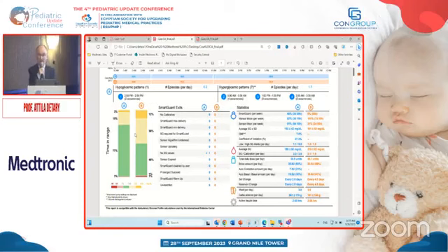So what you also see in the statistics is that we have the GMI information for the recent 2 weeks. It is 7.0%. Imagine you put the patient on this technology and in a couple of weeks, the expected hemoglobin A1C, the GMI, is 7.0%. So the algorithm took your patient into good control. Okay, and this is not a very well educated patient. We will see in the report that this patient still makes mistakes. However, the algorithm is able to correct a lot of mistakes and eliminate this human factor.